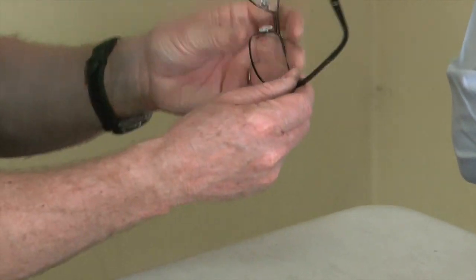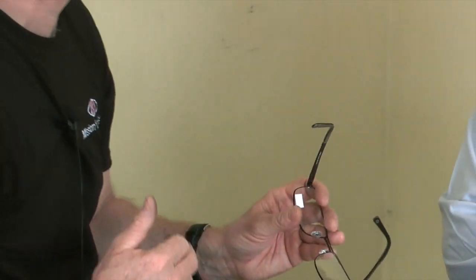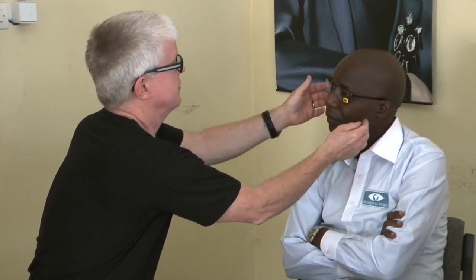Usually most people have ears the same height, but not always. Sometimes if the glasses are sitting at an angle, it could mean that one ear is lower. So you need to adjust each side differently to fit their different ears. That's very common, because otherwise the glasses will sit unevenly. You'll notice — if you look at the camera, Remy — the glasses are down that side, they're sloping downwards.